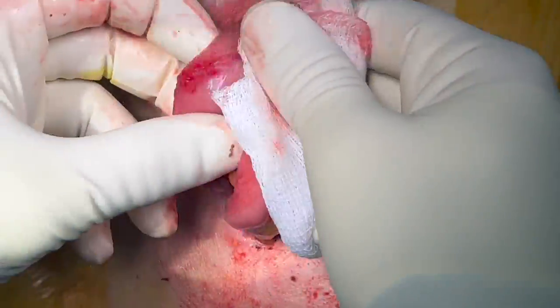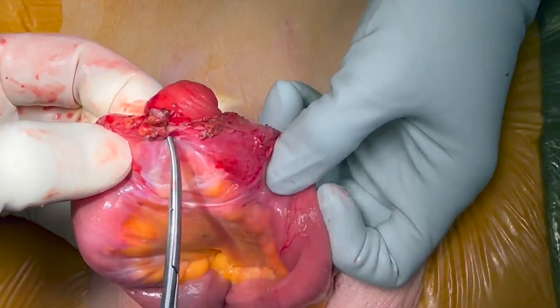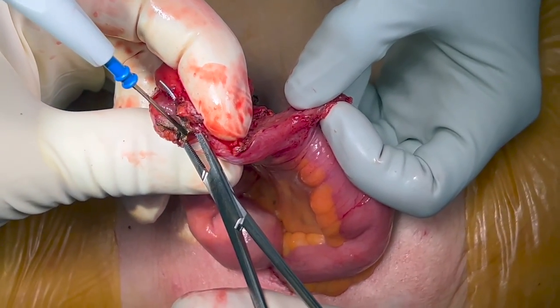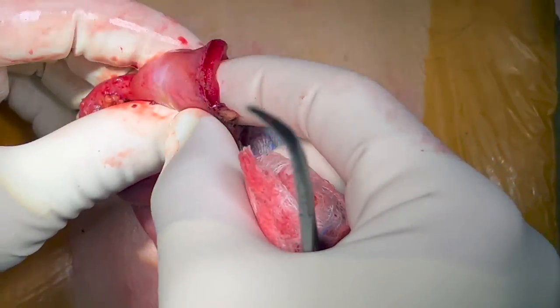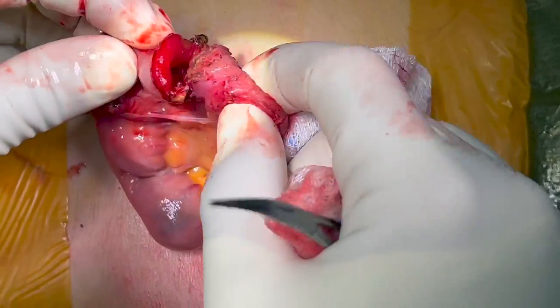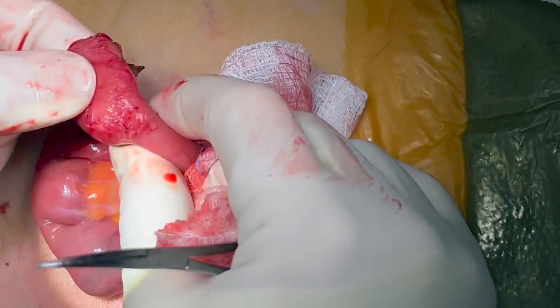The ileostomy is excised with its fibrofatty tissue, and a viable segment of ileum with intact serosa and adequate blood supply is prepared for the anastomosis. If the stoma is everted, careful adhesiolysis may be used to flip the everted bowel back into a normal configuration. Once the bowel is properly mobilized and inspected, a stapled or hand-sutured closure is performed.